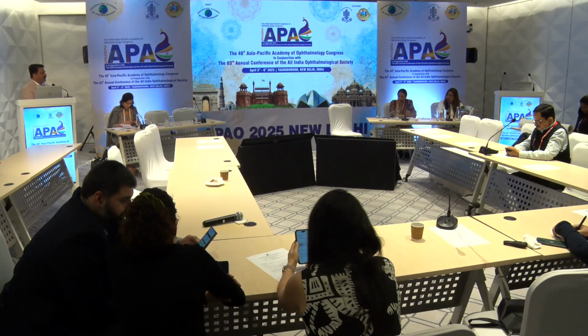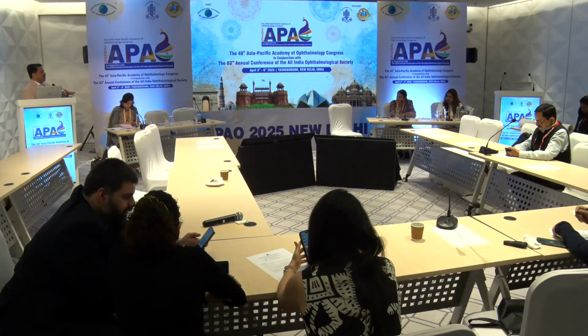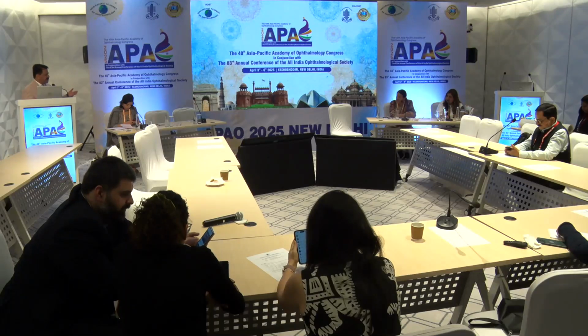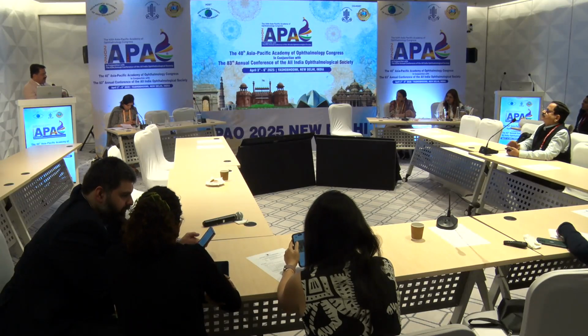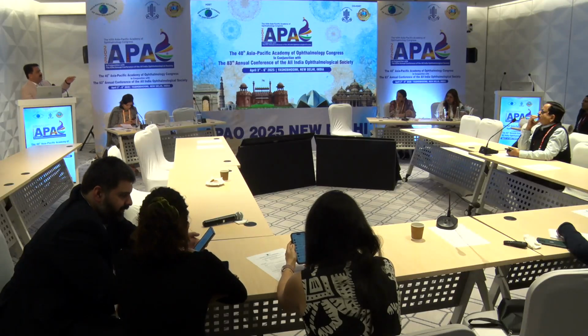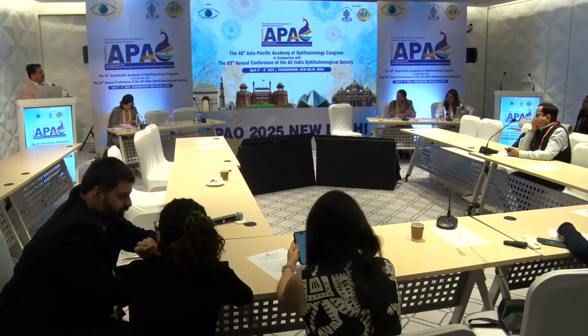And if the air bubble is not there at all in any particular case? The third sign, as I said, that patient actually had a visual. By the time the first right eye lenticule was taken out, he said that he started sweating. So the anesthetist said you will have to wait. So we waited. And by the time I went to the microscope, there were no air bubbles, and the incision also was not seen. So we located the incision from the direction where it was, made a small nick there, and from there we used air bubble signs 1 and 2, because in that case you can go anterior to the lenticule and posterior also. So air bubble signs 1 and 2 will help, and then you can remove this lenticule easily.